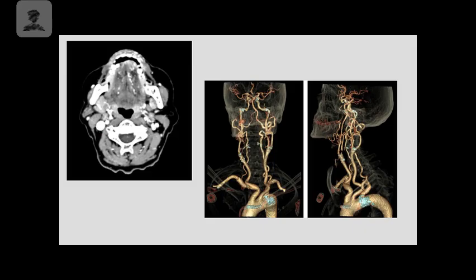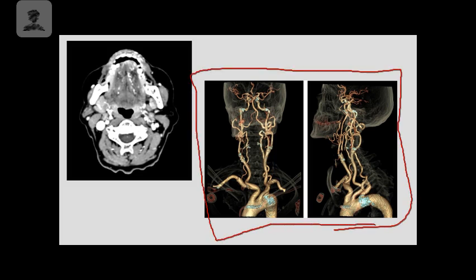One thing that is cool that I mentioned is that we can do 3D reformations with post processing. So it's really interesting because we get to choose how much anatomy we want to be visible. So, like over here, it's a special software. You can still see some of the bony structures. And you can actually see the patient has a portacath placed. You can see that on the chest right here. But we get to decide if we want to keep all these extra structures, or we can choose to basically delete them out and then only see the vessels.